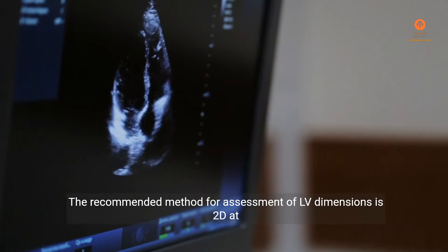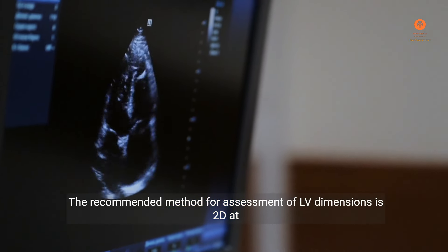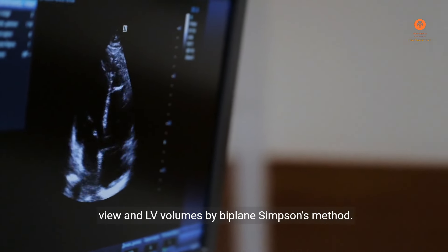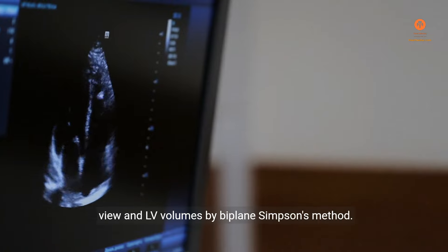The recommended method for assessment of LV dimensions is 2D at the level of tips of mitral leaflets in parasternal long-axis view and LV volumes by biplane Simpson's method.